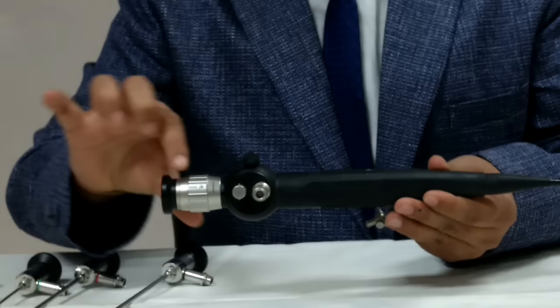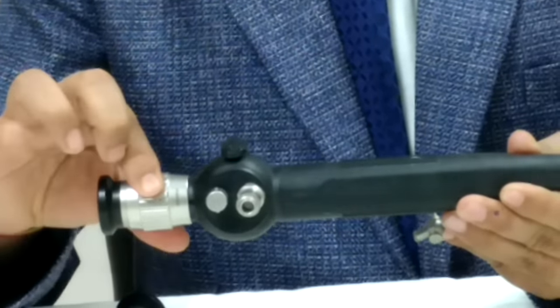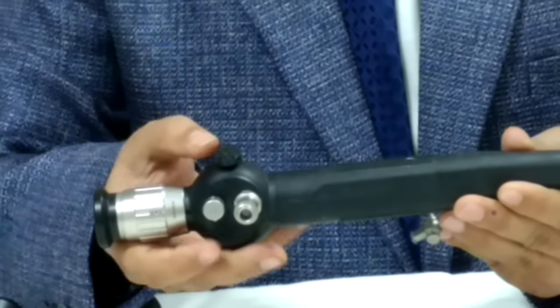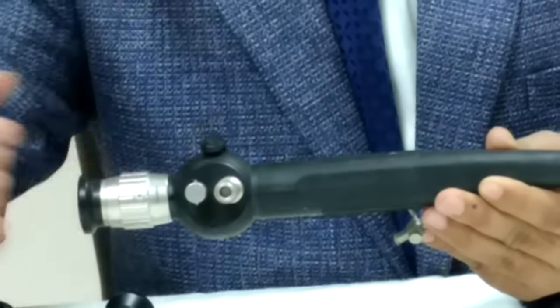You can see this is eye piece. This is to adjust your focus and suppose you are attaching a camera to adjust the focus. This is part for light source to be attached. Fiber optic cable to be attached.